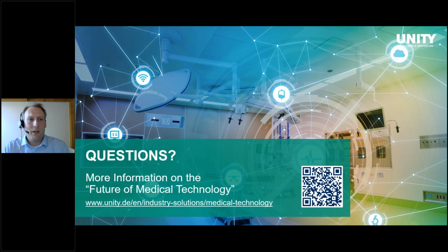For that aspect, during the research projects that in the end led up to the OR.NET consortium, we also had this question, and it was a big topic from one of our partners from the consortium at that point in time. So we included something into the domain information model, which is called a workflow context, where basically information from lab systems as well as information like patient conditions, problem list, and so forth can be transmitted using the SDC protocol. For reference purposes, it, for example, also includes, if this is a DICOM source, the information so that you can connect, for example, directly to the DICOM source as well, using that information, if not all the information is transmitted.